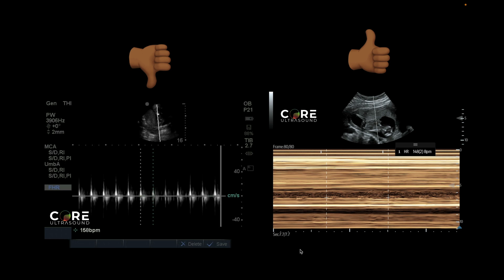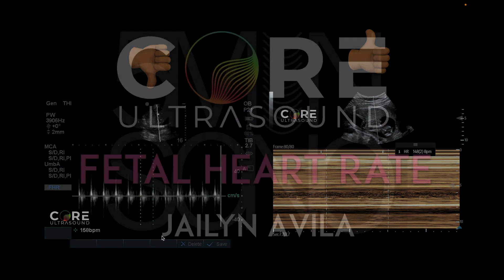There's the ALARA principle — as low as reasonably achievable — which basically means if you can get information with less energy, you should definitely do that. It's the same thing: if you can get the diagnosis via an x-ray rather than a full CT scan, you should probably get that x-ray. Same thing here — if you can get the fetal heart rate with M-Mode, which often you very much can, get it with M-Mode instead of with the higher energy pulsed wave Doppler.